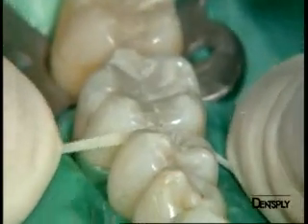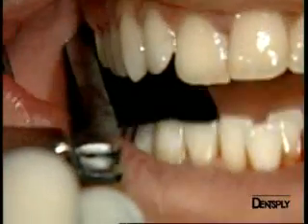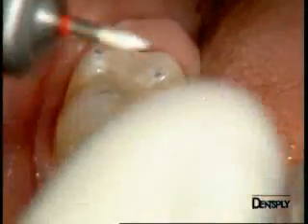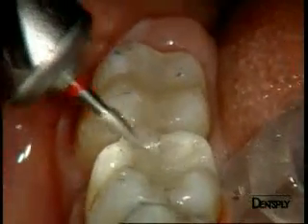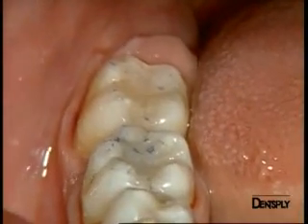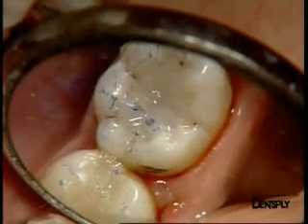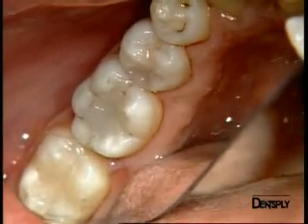We check the interproximal contact point using silk dental floss, and you can see that we have obtained an excellent proximal contact. The articulation is adjusted after having removed the rubber dam. The high spots of the filling are removed with the same burr used for the finishing. A second check is carried out, and you can see how the creation of normal occlusal anatomy enables us to easily obtain a tripod as described in the dental literature, allowing us to position all contact points with the opposing teeth.